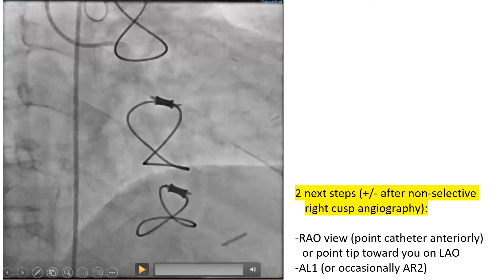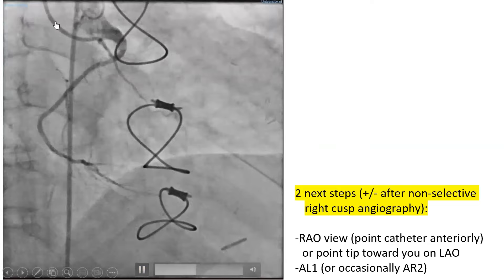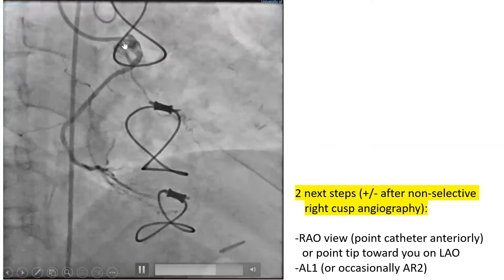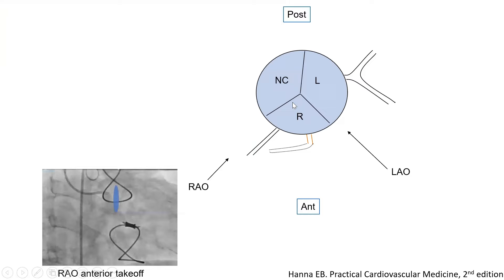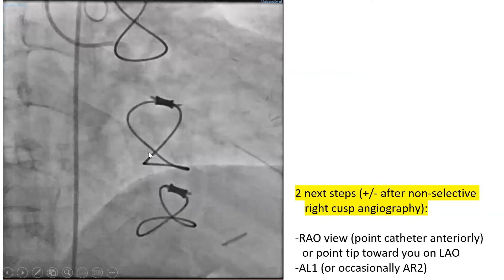Here is a case using an Amplax left 1 catheter in RAO view, aiming the catheter anteriorly to engage an anterior-origin RCA. A pitfall with RAO view: as you maneuver, your catheter may jump to the left cusp without you knowing. I've learned to use LAO view to confirm I'm in the right cusp, make the AL catheter point at me, and then briefly use RAO to confirm it's pointing anteriorly. Two steps: make the tip point toward you in LAO, and use AL1 or occasionally AR2.